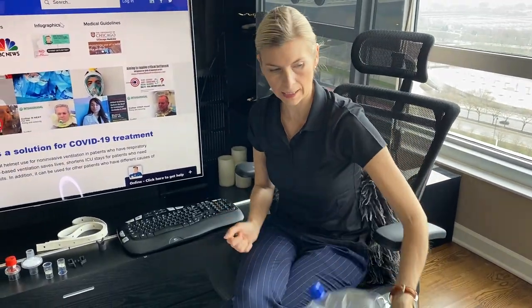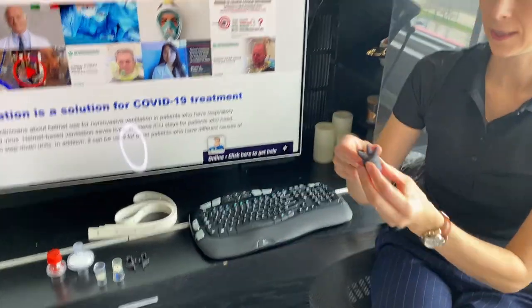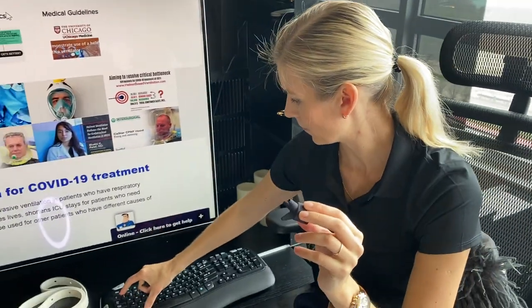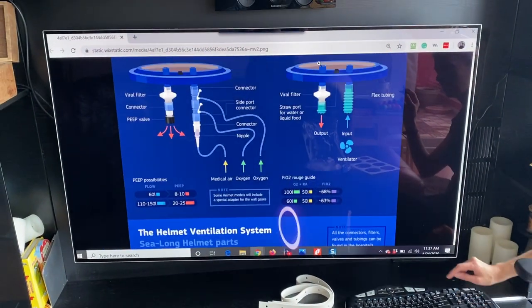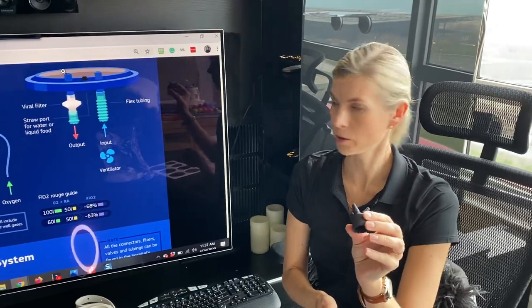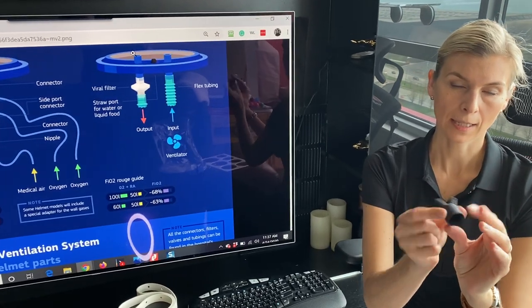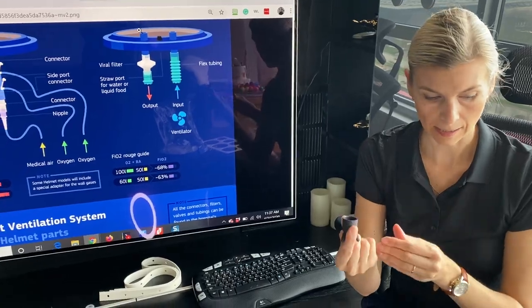Other things in the helmet kit include this special adapter. It's a very useful piece — as shown in our infographics, we use these connectors to make sure that all three gas sources are connected to the helmet. This makes it easier for the clinician and saves supplies, so you can connect it straight to the helmet.